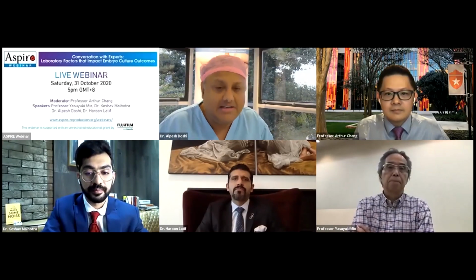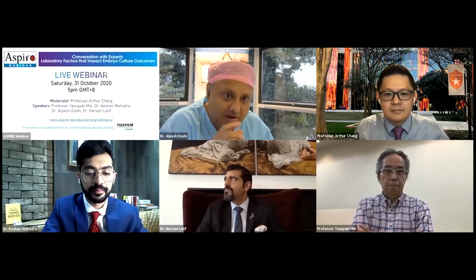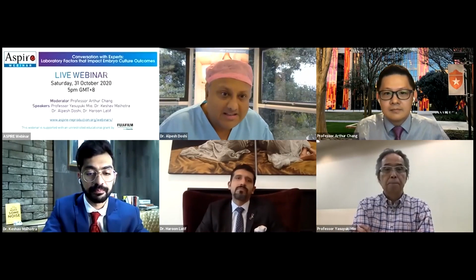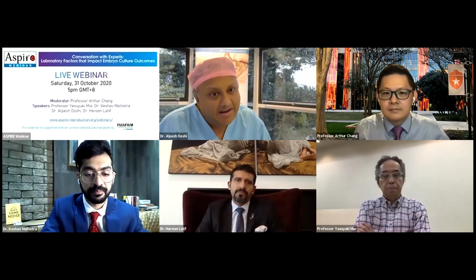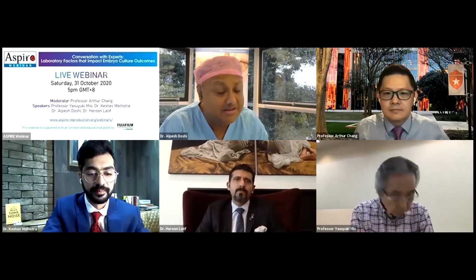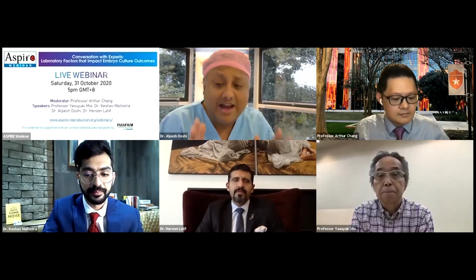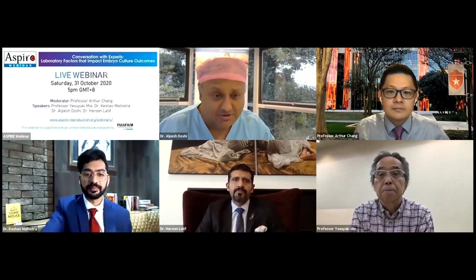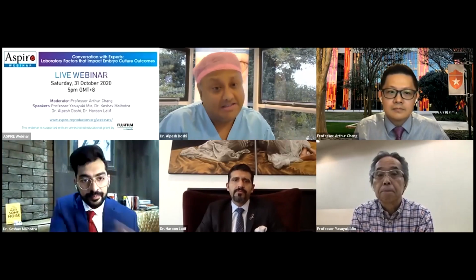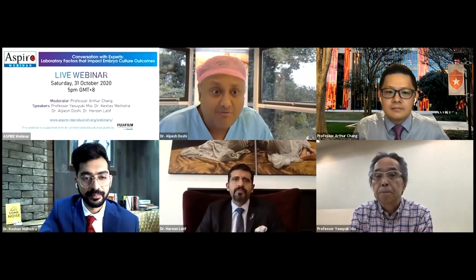Now, some studies have looked at using something like an ICSI pipette to go in and take some cells out. And again, the success of this has been very, very limited. So by and large, trophectoderm biopsy has become the gold standard. However, going to the next question, yes, this is linked to the fact that inner cell mass is more valuable.